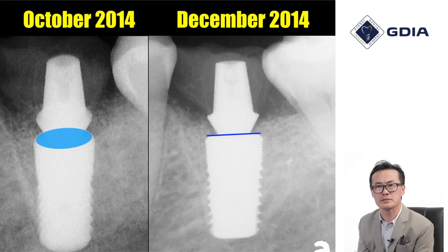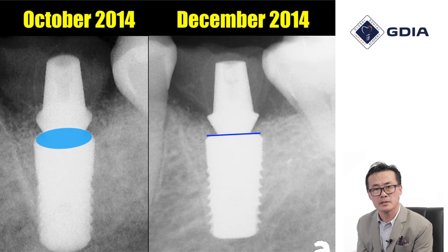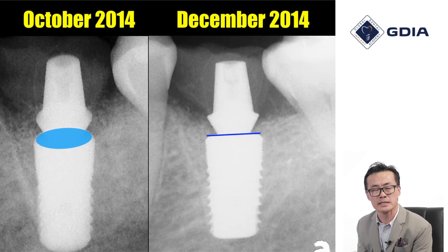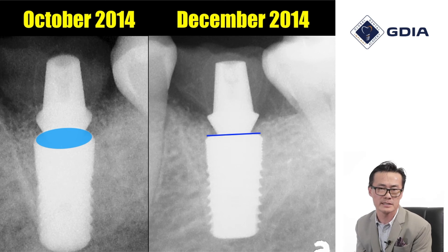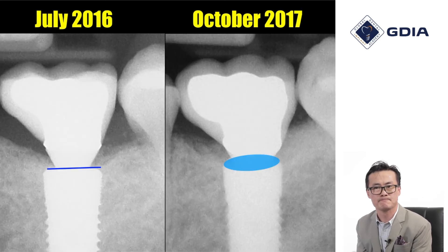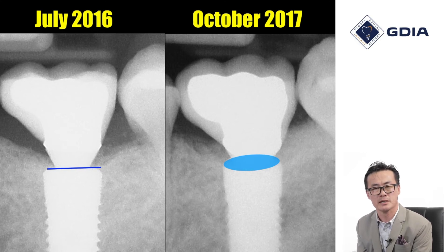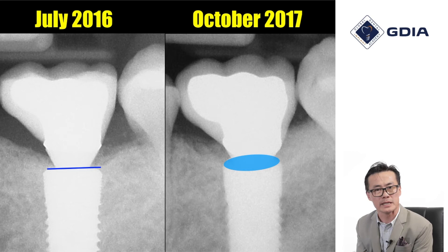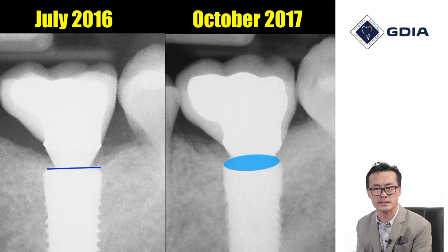When we compare these two images very carefully, the image on the left shows an oval at the interface whereas the image on the right shows a straight line at the interface between the implant and the abutment. The same thing is observed in this pair of images: on the left there's a straight line and on the right there's an oval at the interface between the implant and the abutment. What does that really mean?